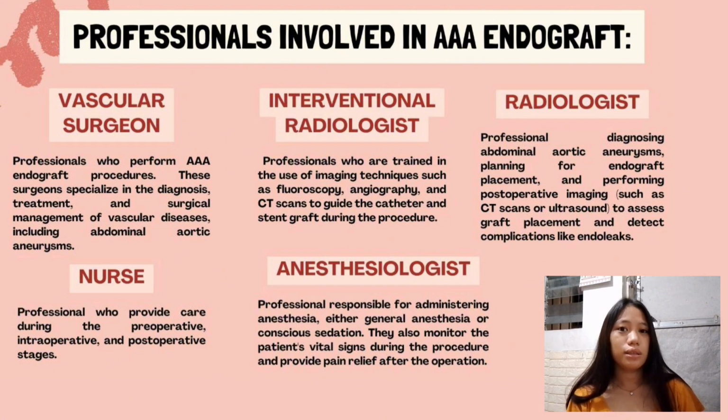General anesthesia is most commonly used for patients who are unconscious or unaware during the procedure. Local anesthesia with sedation is used in some cases for patients who are stable, and the process is less invasive or complicated.